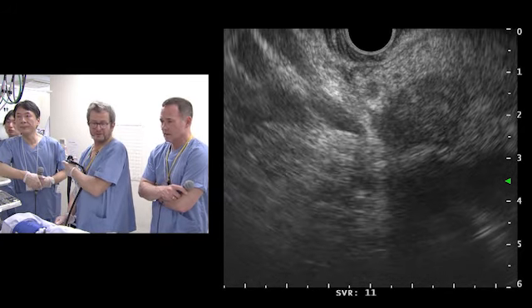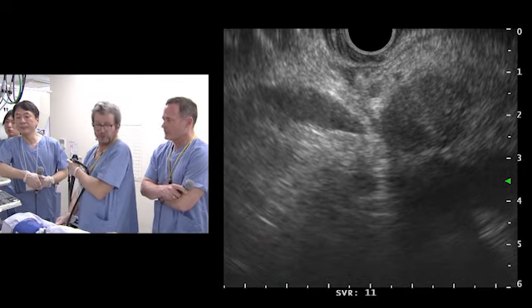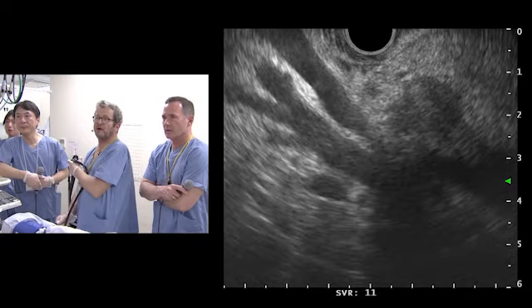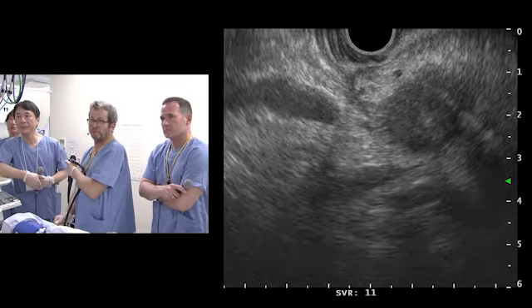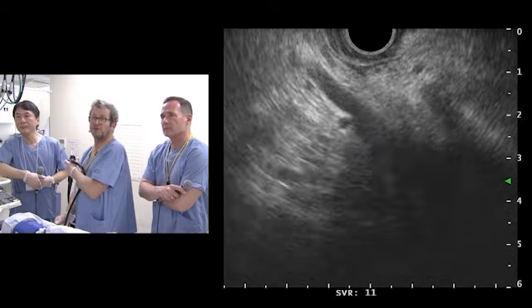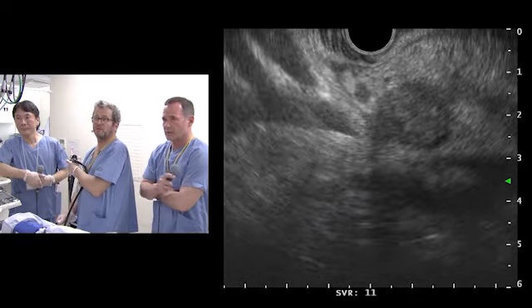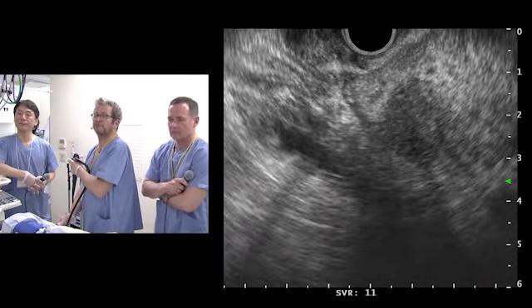So it's an excellent case for resection. So it's better that we have the pictures, which are sufficient, and furthermore we have an excellent staging, and there is only one lymph node. Okay. So I prefer it's better to be safe.